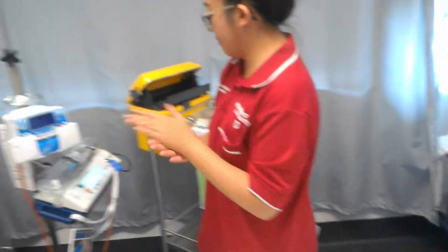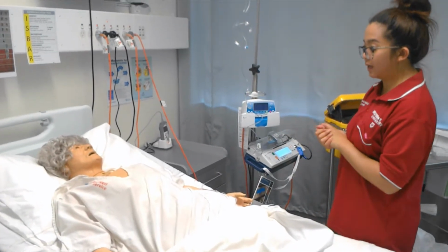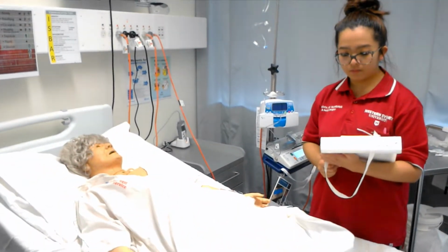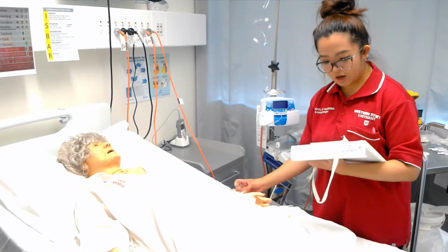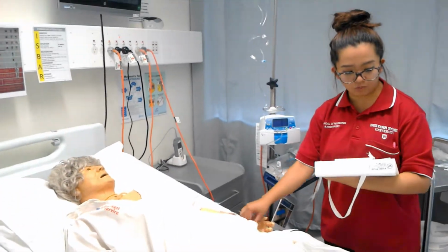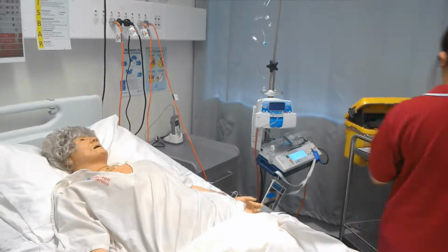Hi, Marianne. I've set up the PCA machine, but before I can do that, I just need to double check your identity again, make sure that everything is okay before I give it to you. Can you please state your full name again? Miriam Added. Your date of birth, please. 7169. Yep, and MRN 174963. Do you have any allergies, Miriam? No. Okay, not a problem. And also, I'll just do my final drug check with my nurse, and then I'll attach that all for you.